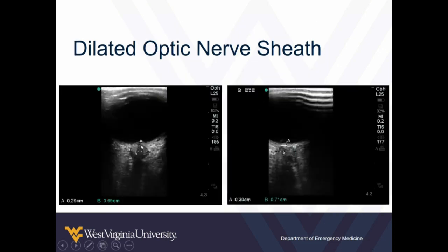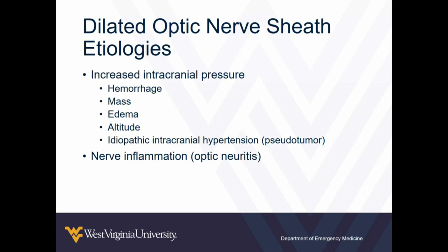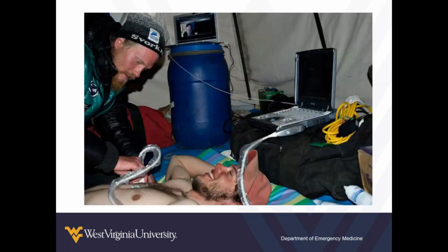Just a couple more examples: here we maybe see a little bit of bulging up, we go back and measure the diameter — it's almost seven millimeters. Same thing here; we see the diameter is increased. So here we think we have papilledema or increased pressure for one reason or another. Why might this be dilated? Most of the time it means there's increased intracranial pressure for lots of reasons — hemorrhage, mass, edema, altitude. You can take ultrasound almost anywhere — people take it to Everest to look for signs of intracranial pressure elevation. And then idiopathic intracranial hypertension — this is probably the most common reason I see this in the emergency department, patients with pseudotumor or IIH. It may also be dilated because it's inflamed, like optic neuritis. You still have to correlate what you see on ultrasound with the whole clinical picture.